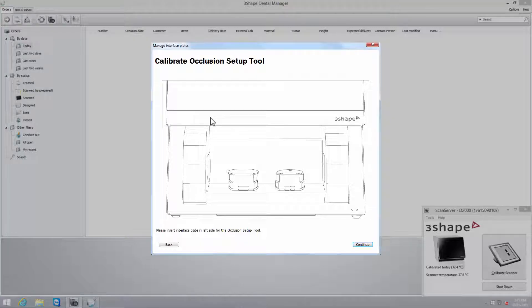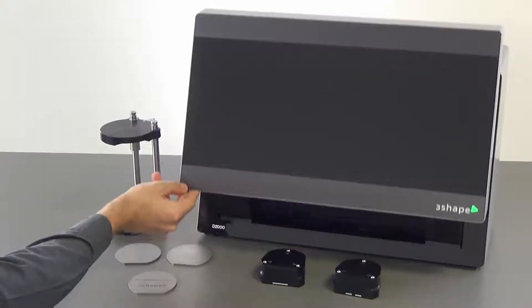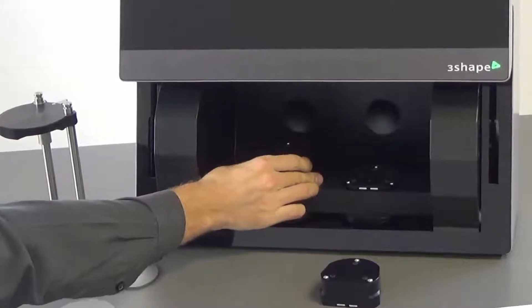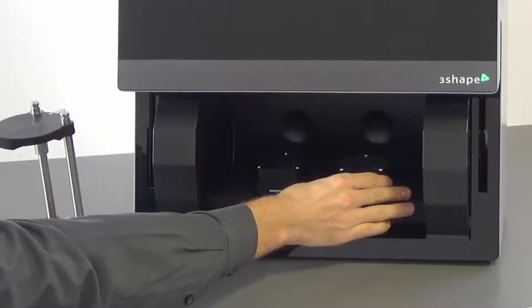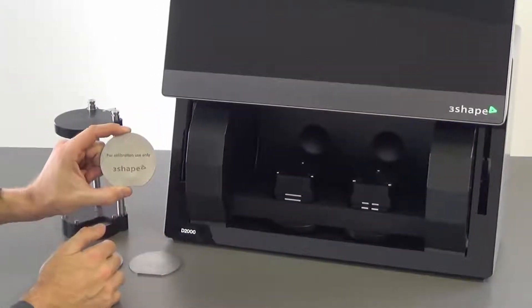A new pop-out window will show you how to place the plates in the scanner. If you are using a large interior scanner, the plates need to be situated on the scan height adapter. The plates are always calibrated one at a time, even if you are using the D2000 scanner, since there is only one calibration plate in the set.